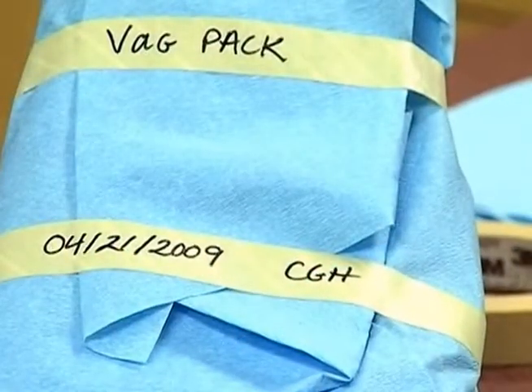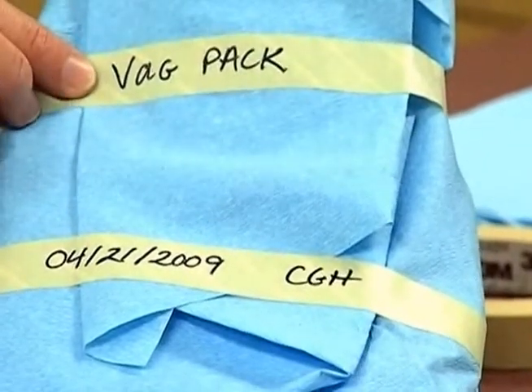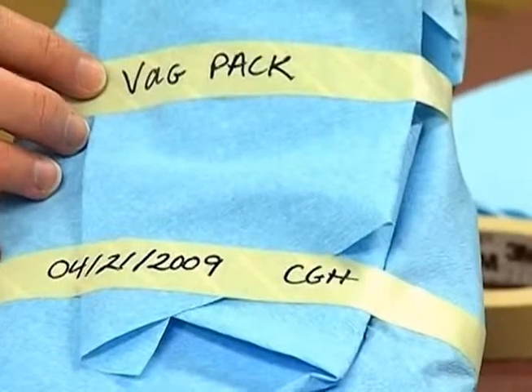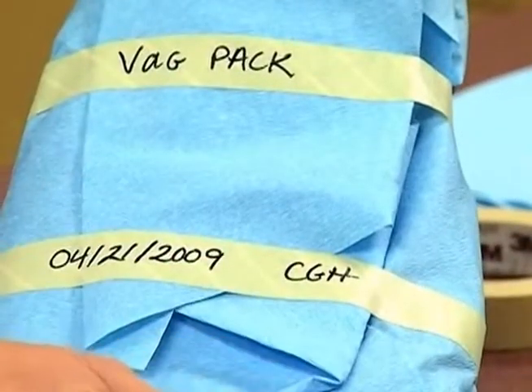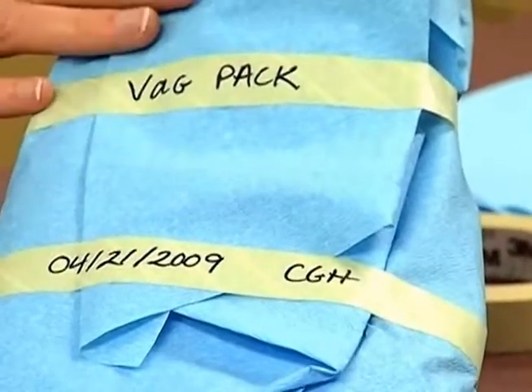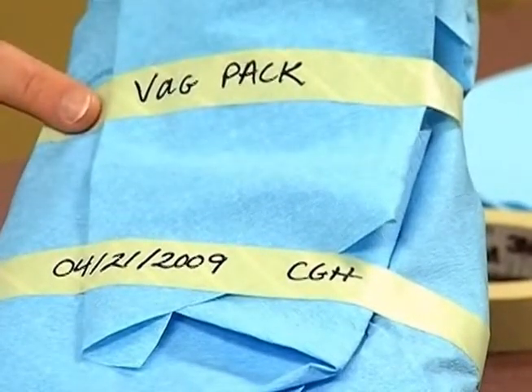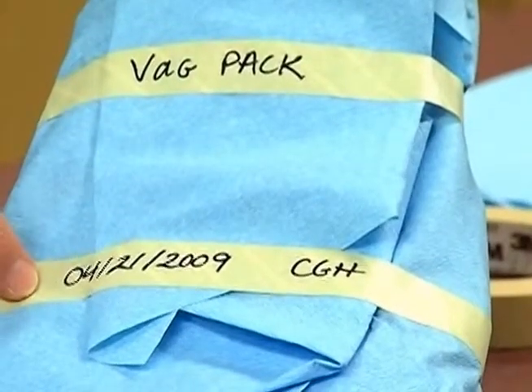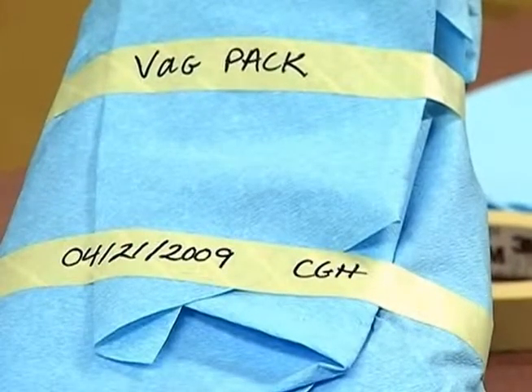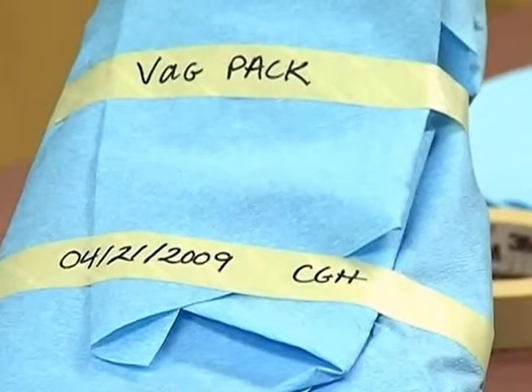Before we put it into the autoclave, we want to make sure it's always labeled. In our office, we use an abbreviation for all the contents of what is inside the wrapped object — we call it a badge pack, so we know it contains this particular set of instruments. Other offices may list every object found inside the wrapping. We also need to include the date that we're going to be autoclaving it, and our initials, to allow people to know who put this together, in case any changes need to be made to the procedure later.